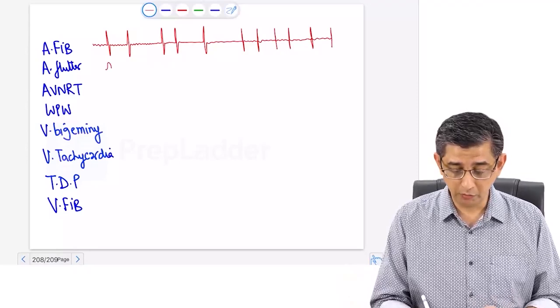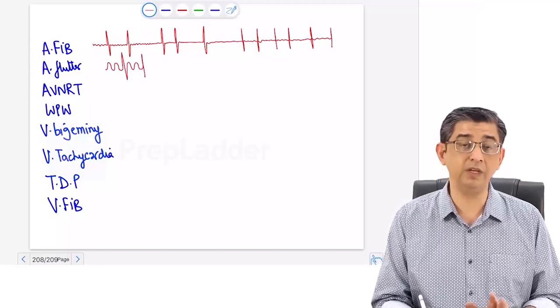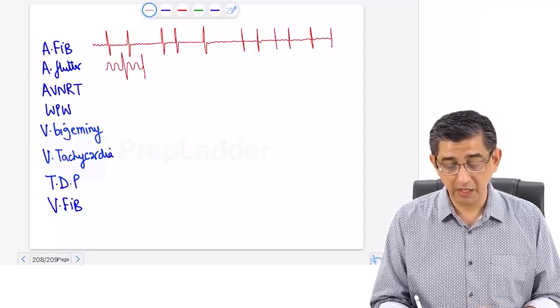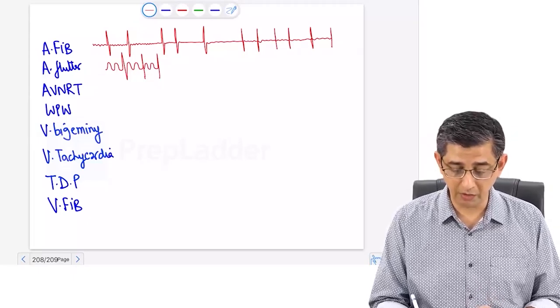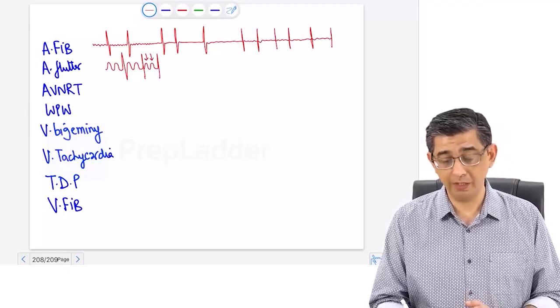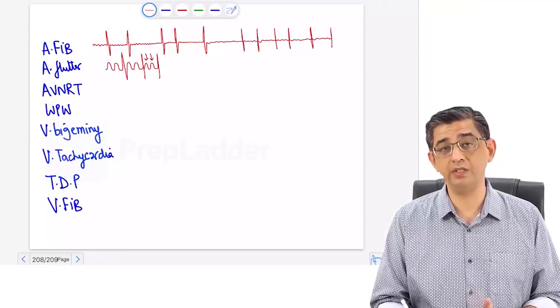In atrial flutter, you will always notice at least two abnormal waves before every narrow QRS complex, and these waves will neither have characteristics of a P or a T, both height wise as well as duration wise. And apart from this, suppose you see two sawtooth waves, like at the moment I have hand drawn two sawtooth waves before every QRS complex. So that means that this is a 3:1 conduction. Don't answer it as 2:1, answer that as 3:1 conduction.